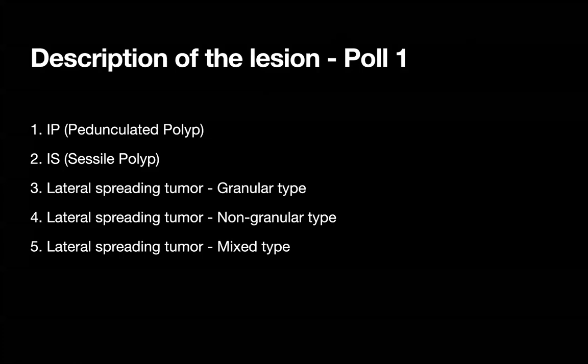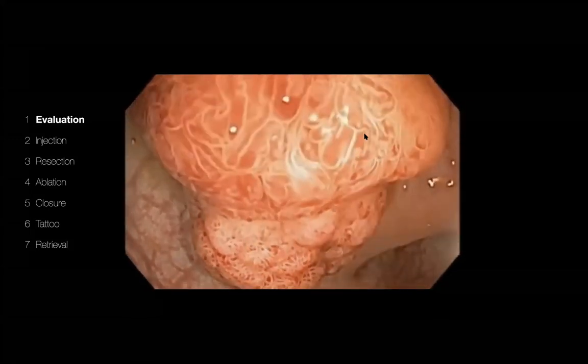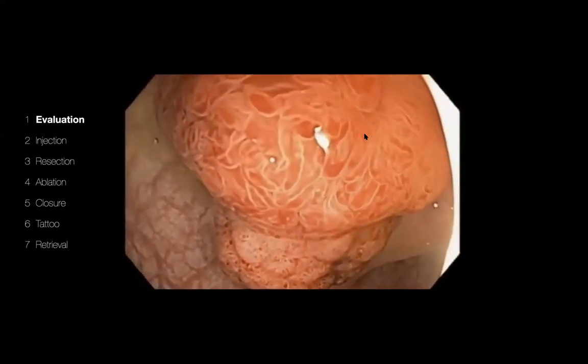What I would like to do is I would like to escape from here. So this was actually a sessile polyp. I was trying to get back to the previous video. Let me see if I can get back to the previous. Okay. Maybe Sylvia can comment on this. I wish I had a longer video. I don't have a longer video. So, and so this is a non-dependent position actually. Okay.